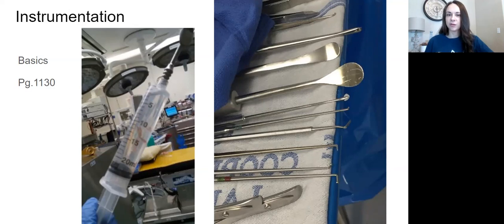So if you know your surgeon is taking big pieces of bone and they ask for a rongeur and they're not specific, you should think a handheld rongeur or a Kerrison. If they're taking out pieces of disc and they say rongeur and they're not specific, you should think pituitary rongeur, so they can take out that piece of disc or soft tissue. So things like that will help you anticipate in neurosurgery. So even if the surgeon doesn't use all their words, all their adjectives, you can use your brain and anticipate what they're going to need. So even if they don't use the right term, you already know what they need.